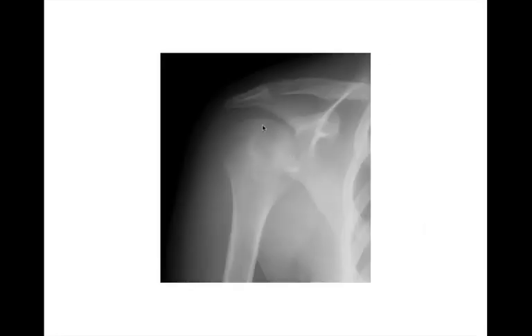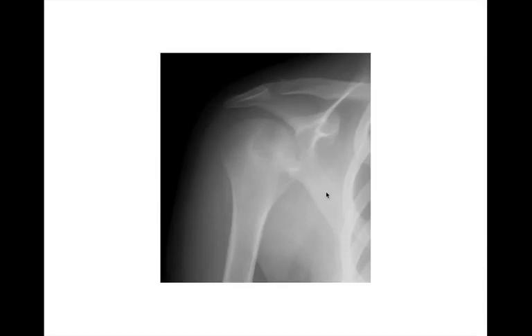Radiograph of the shoulder: geographic lytic lesion eccentrically located in the epiphysis of the proximal humerus, narrow zone of transition and sclerotic border — a geographic 1A lesion, slow-growing. This is a young patient with an epiphyseal lesion, so chondroblastoma should be the first thing that springs to mind. It's also reasonable to think of a Brody's abscess. Langerhans cell histiocytosis can occasionally look like this but is not common in the epiphysis. Geographic lytic lesion, sclerotic border, epiphyseal location, younger patient — really think about chondroblastoma. This is a nice example of one.